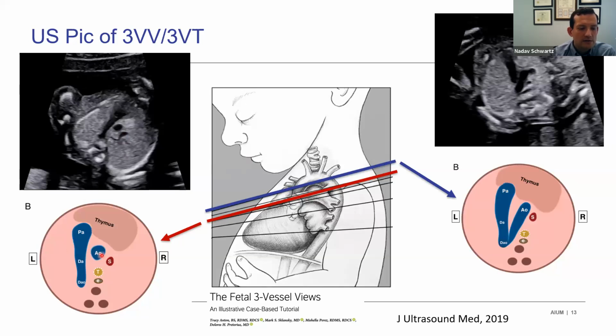And here we see it in the cartoon, and they put in the trachea and the esophagus, which we don't see in the ultrasound picture right now, but if they're dilated, especially, you can see them back here. You can often see the thymus. It's not pictured that well in this image, but this would be the area of seeing a thymus gland, which is a normal large structure in a fetus and eventually involutes with increasing age after birth.